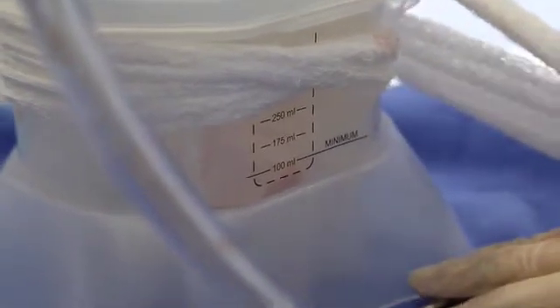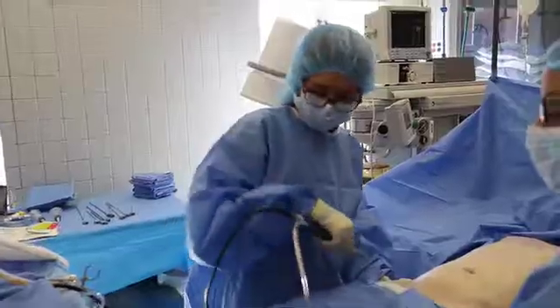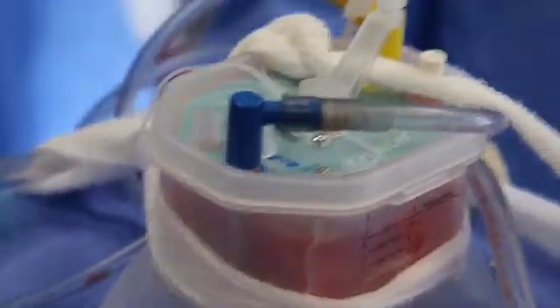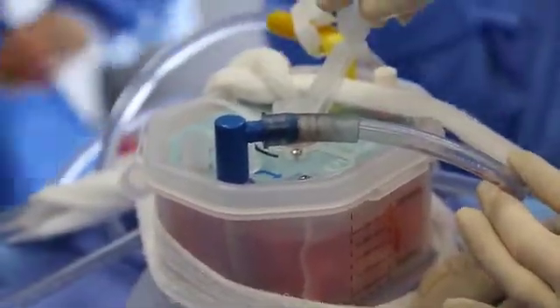The fluid is going into there. The excess water and oil is getting filtered through the screen. See how it's nice and no blood in it. We've gotten all the oil and some extra water out in there. But what this does that's extra is it gets all the fibrinous junk out — the tissue that's not fat.